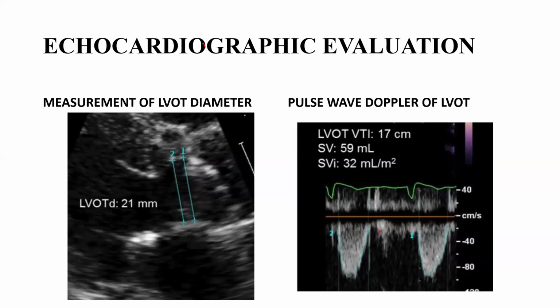Please, do you understand that one? I understand. Excellent. Thank you. So the question is, why is this one not generating enough EF? Sorry, not EF, why is it not generating enough gradient?